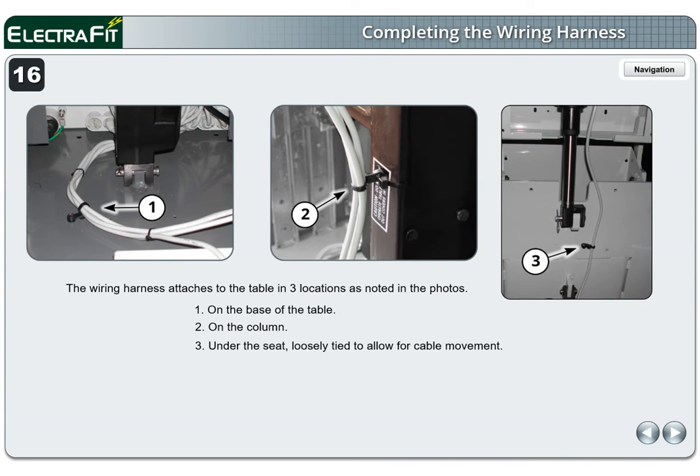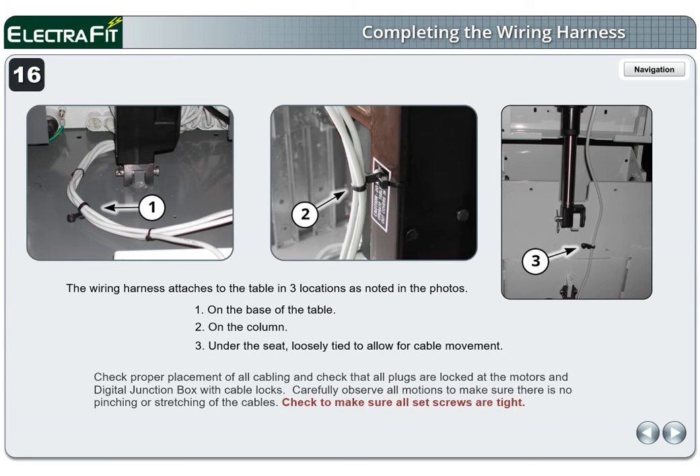Location 3 is under the seat, loosely tied to allow for cable movement. Check proper placement of all cabling and check that all plugs are locked at the motors and digital junction box with cable locks. Carefully observe all motions to make sure there is no pinching or stretching of the cables. Check to make sure all set screws are tight.